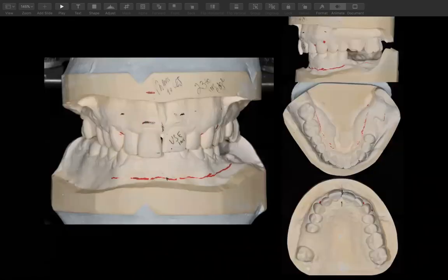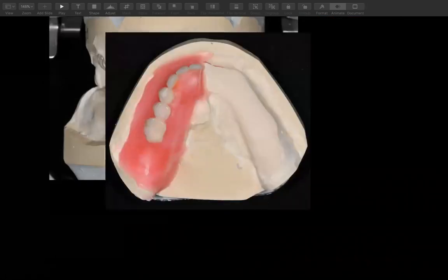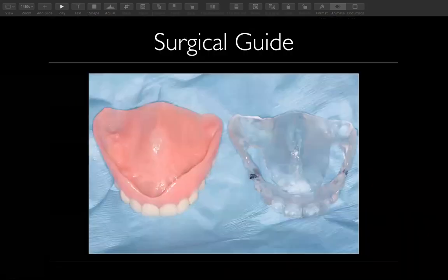In this particular case here, the doctor cut the incisal edge on number 9 and wanted me to use that for the incisal edge, and 12 millimeters to the CEJ. So we set this case up according to what they wanted without losing our reference, and did it in stages. And again, this is that clear guide that we talk about.